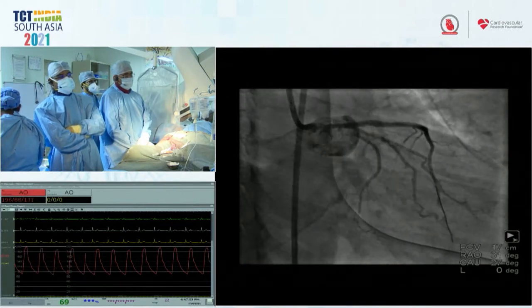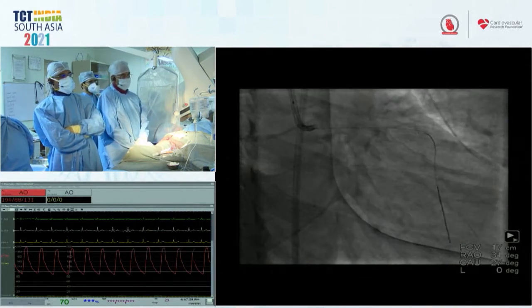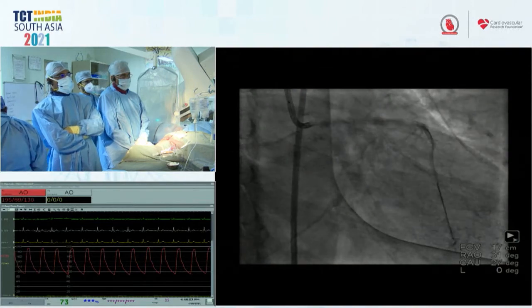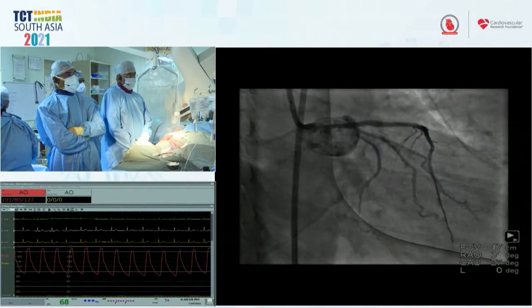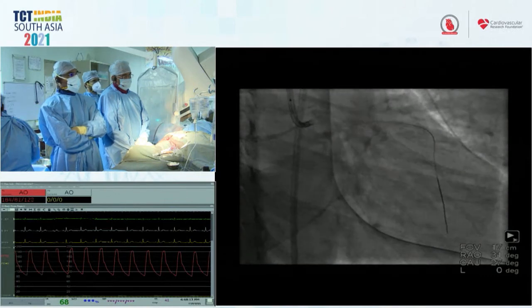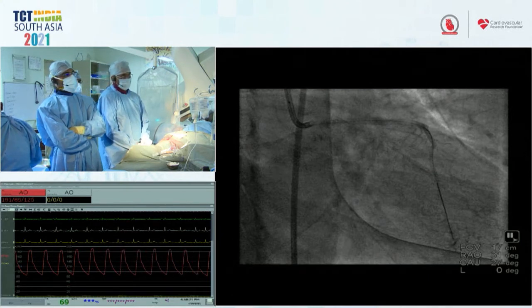Putting 2 layers over the circ may not be the best long-term protection of the branch. And I think there's little downside unless you really think that you may end up missing. Thoughts from the panel? I think if you're short on the stent, let's say a 12 or 15 or close, you can always go a little longer. I don't know if you have ostial flash there, but it's a way to deal with a little bit of extra margin of length if you hang out a little more than you need to.